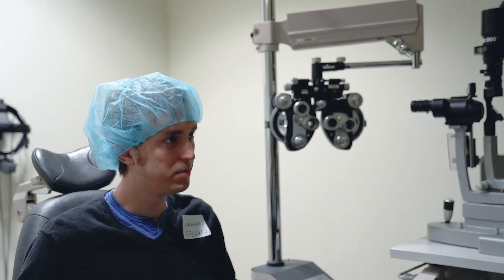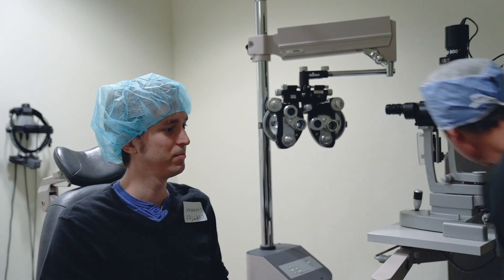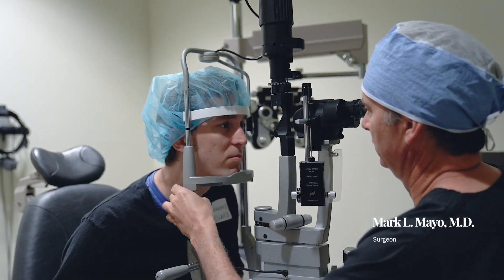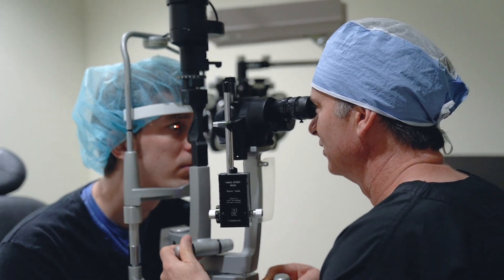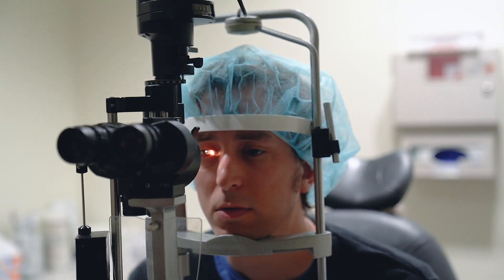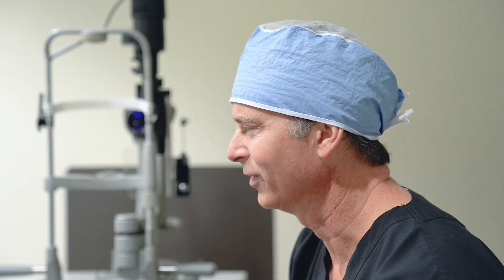I'm going to take a look at your eye here myself, and then we'll go over a couple of things. Put your chin right in there for me. That looks good. Perfect. Whenever we do a high astigmatism treatment, I kind of warn everybody that your vision can fluctuate a little more early on. A lot of times when we do just pure myopic treatments, like the next morning everybody's like wow, this is great. So you'll notice your vision's going to be greatly improved by later today, by tomorrow morning, but it'll continue to improve over a few weeks. There's a little more variability when you have a lot of astigmatism treatment, so that's just something to be aware of.